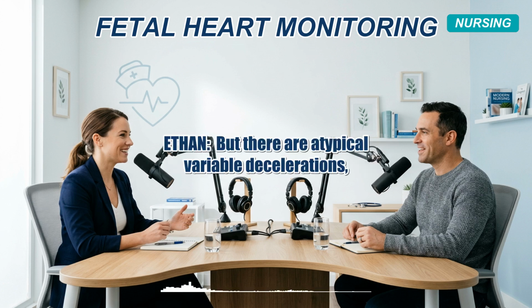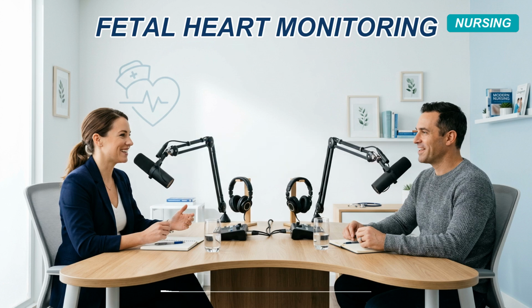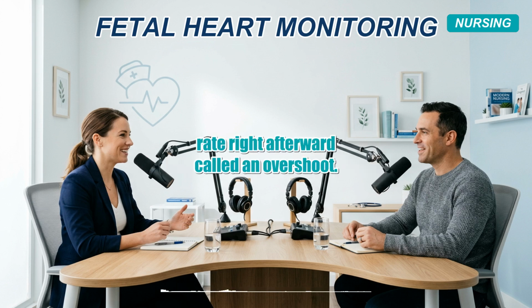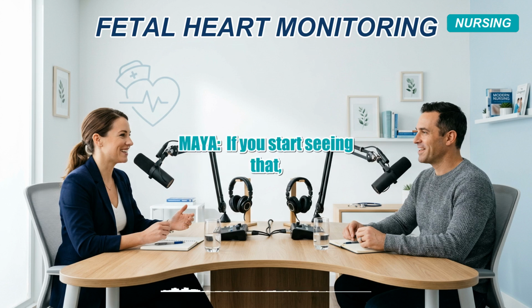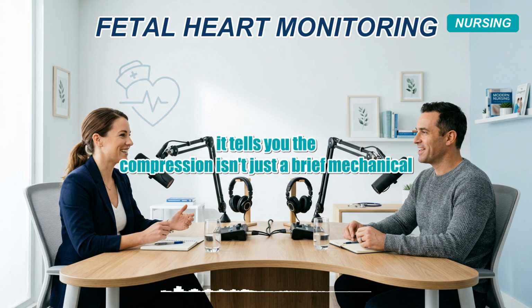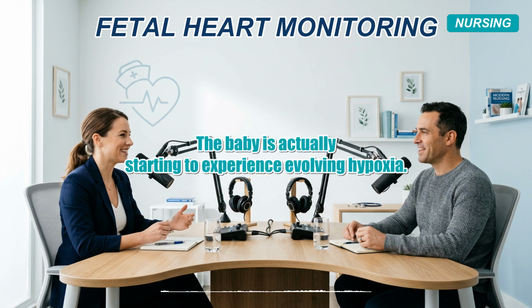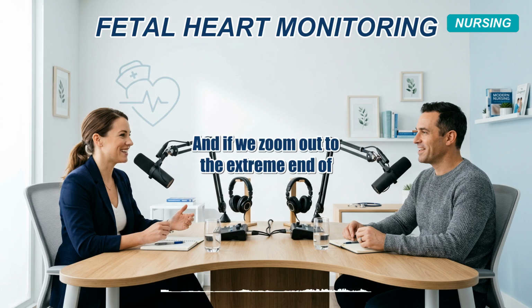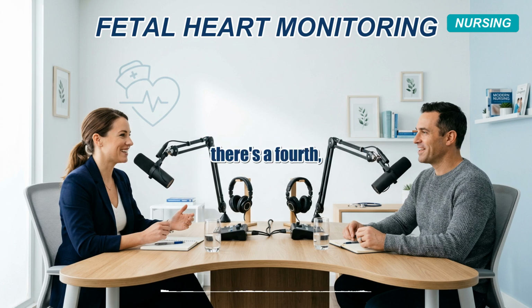But there are atypical variable decelerations, right, where the cord compression is more severe. Yes, that's where the heart rate is slow to return to baseline, or maybe there's a strange secondary spike in the heart rate right afterward called an overshoot. Oh, an overshoot. If you start seeing that, or if the tracing loses that wiggly variability, it tells you the compression isn't just a brief mechanical squeeze anymore. The baby is actually starting to experience evolving hypoxia. They're slowly losing oxygen.